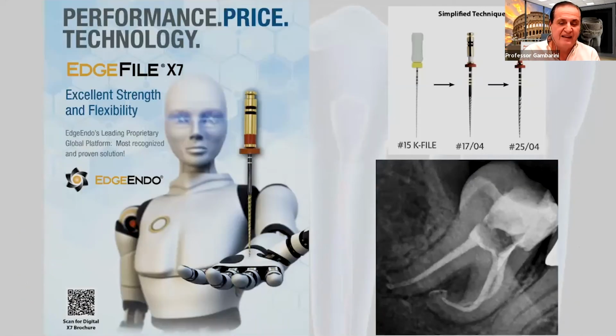Or this is a very interesting technique, the simplified technique. I'm always using the simplified technique, as I explained to you. 2 instruments, excellent strength and flexibility. And I'm very happy about this.